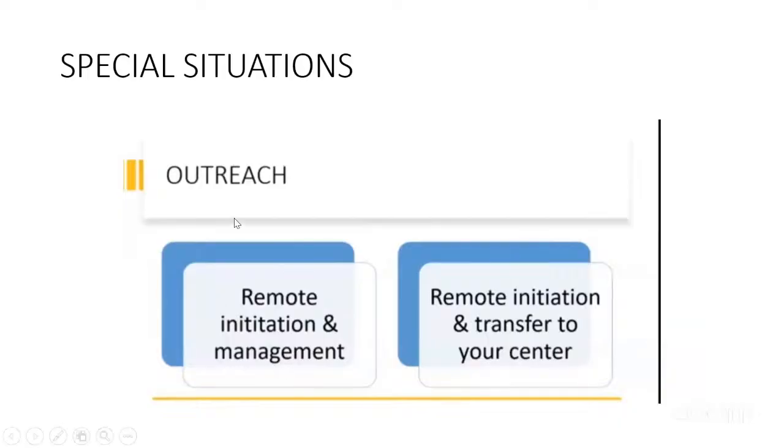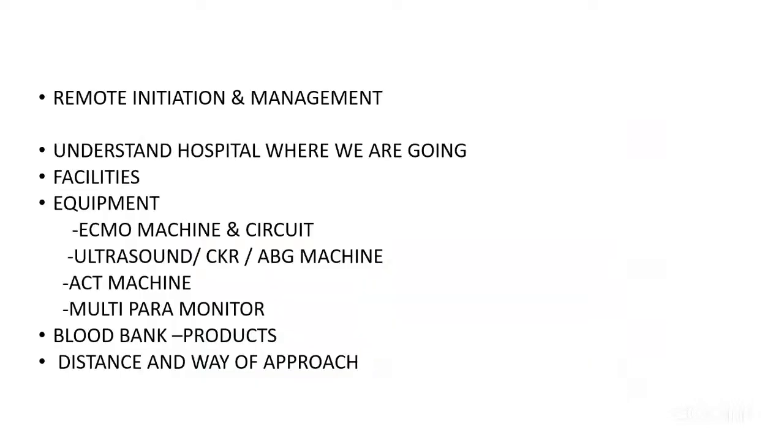Now you come to the special situations, such as an outreach situation, where you want to initiate ECMO in a remote hospital and manage there with the support of the local hospital team, or sometimes you initiate the ECMO in a remote location and transfer the patient to your center. So what are the important points for initiation and management?